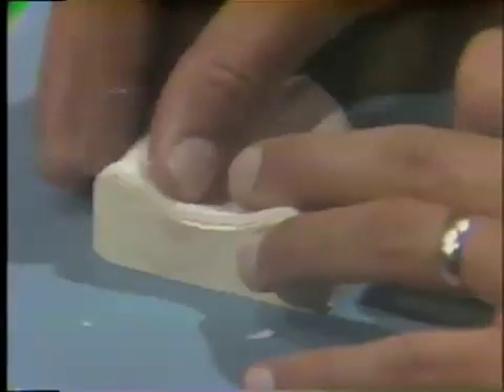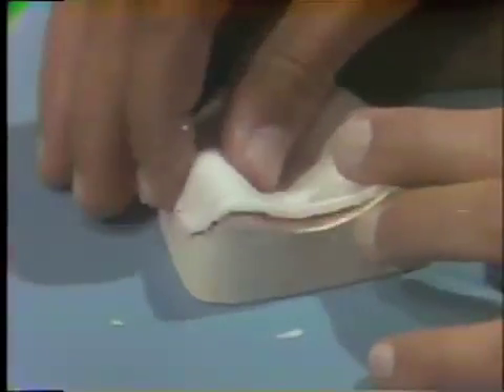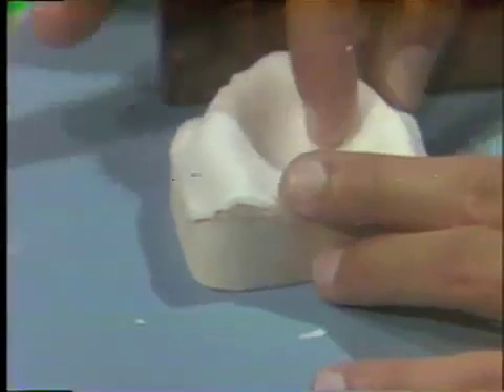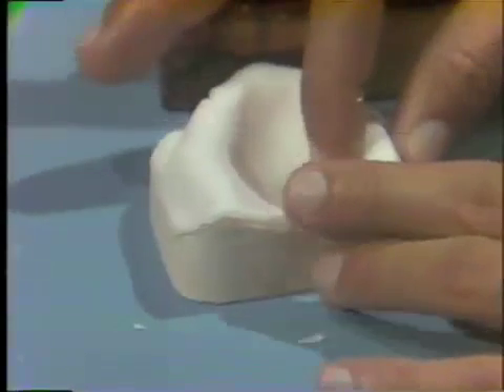At this point, you may set aside the maxillary tray and repeat all the procedures for the construction of the mandibular tray. Then, you may resume construction of the maxillary tray while the mandibular tray is polymerizing.